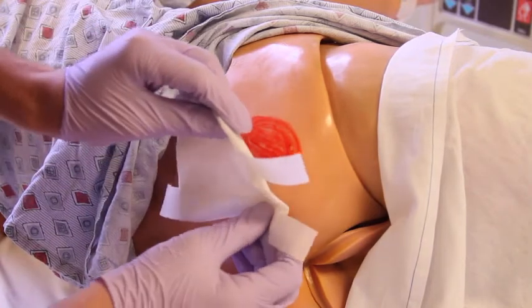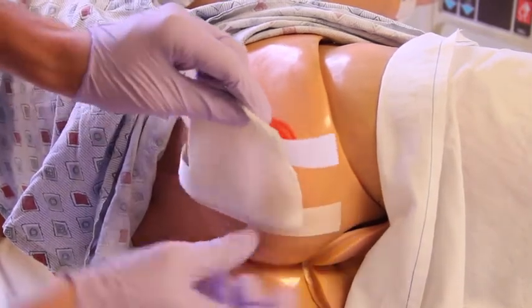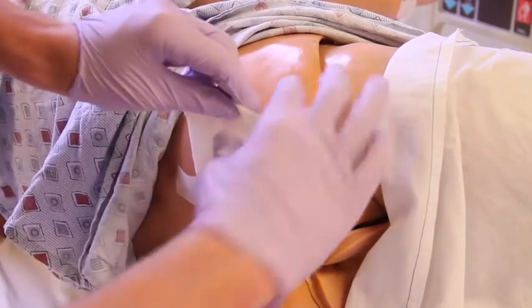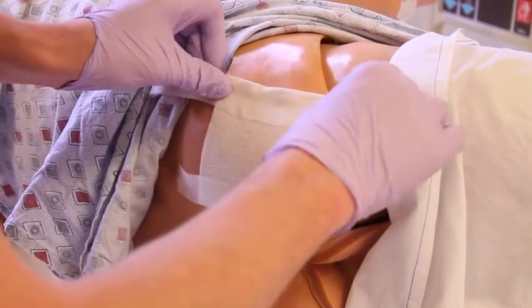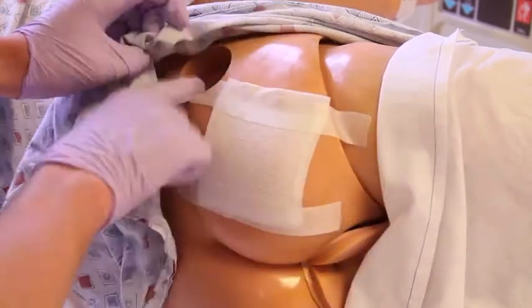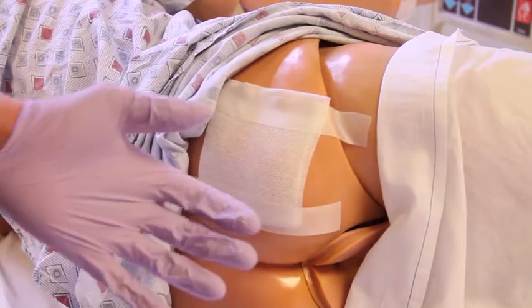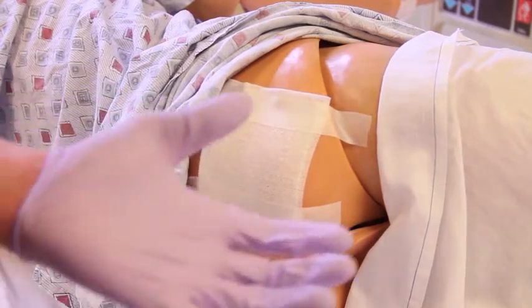You take it and tape it on, making sure the tape is away from the wound and only the gauze is actually resting on the wound. And tape it into place. And then after that, you can reposition the patient, make sure they're comfortable, and everything went well.